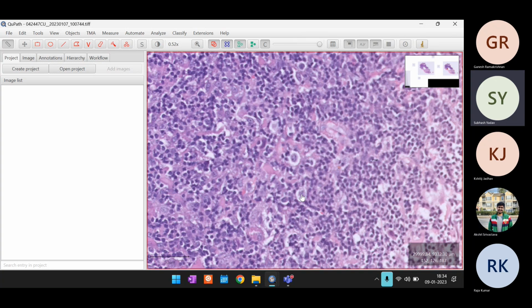But what I'm saying is that the clear zone is not specific. Sometimes you may get it, sometimes you may not. It is all processing dependent, so we can't use that as a characteristic. But the size characteristic is definitely there.